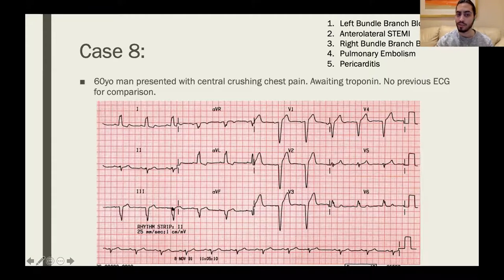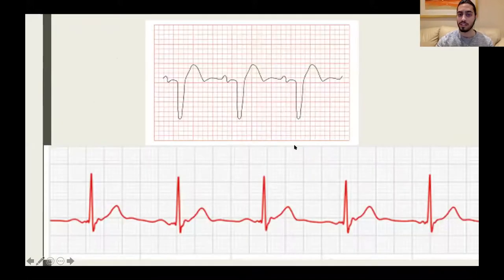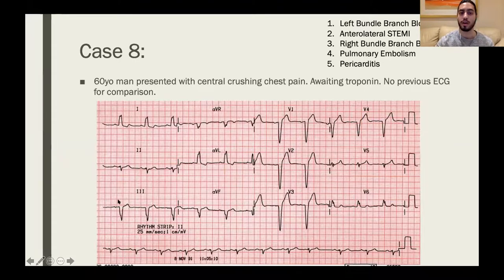broad. So if you look at previous ECGs that we looked at, or we'll come on to it actually, if you look at normal ECGs, the QRS complex is very narrow. It's kind of like just one line here, right? These are looking very, very broad for a QRS complex. Whenever you see broad QRSs, something is affecting the conduction that's resulting in impaired ventricular contraction. You've got to go straight to thinking about things like bundle branch blocks.